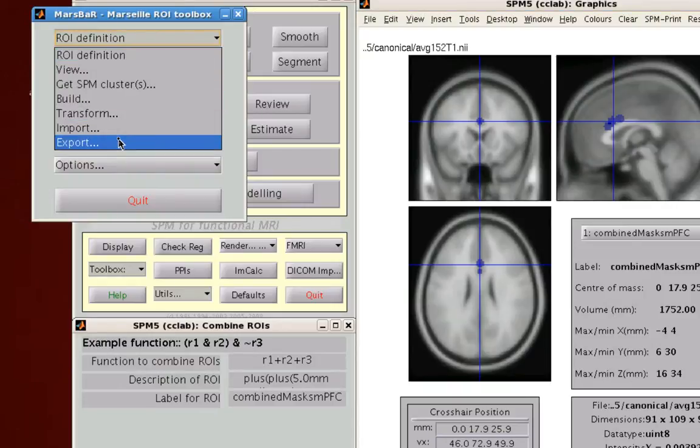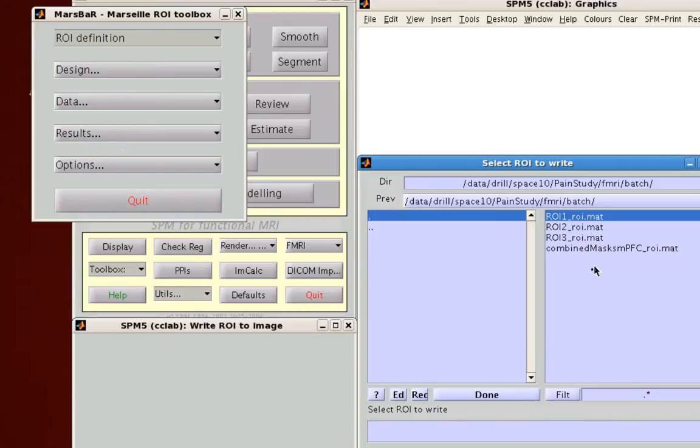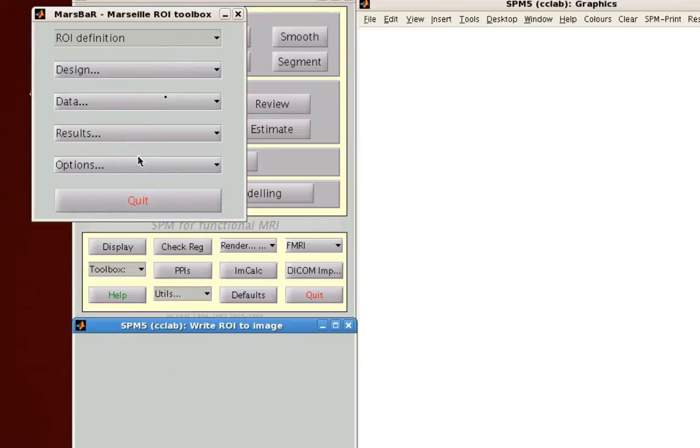So I'm going to go to export and export these ROIs to an image. That'll export it to a single image.